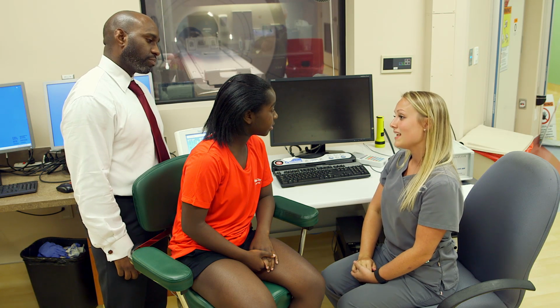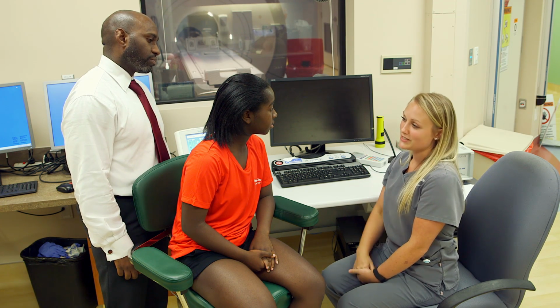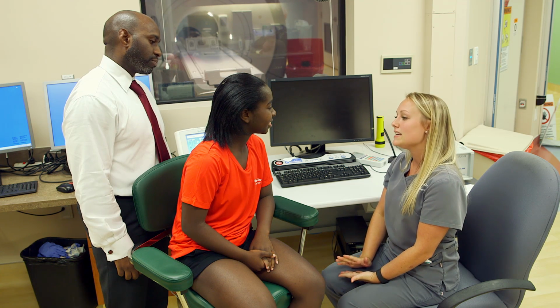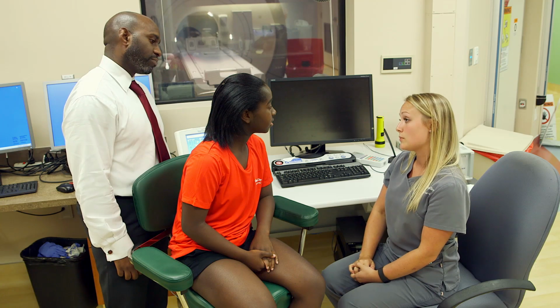How long does it take? It normally takes about an hour, about the same time of your two favorite TV shows. To help you keep still, you can daydream about your favorite place, take a nap, or even listen to music. But you can't listen to music from your phone.